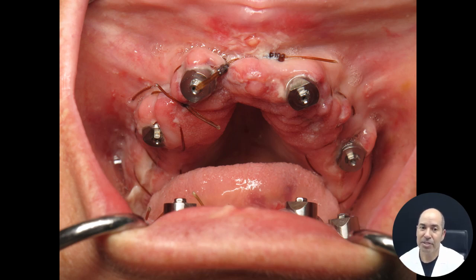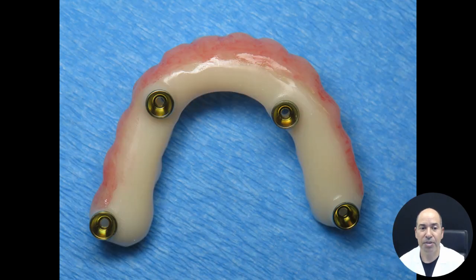This is what the top jaw looks like just 24 hours later. She's still numb from the day before from a special anesthetic that's given for numbness. This is not very painful. Unscrew those. And you can see the lab fabricated temporaries or provisionals or prototypes, I call them. These are not the final.